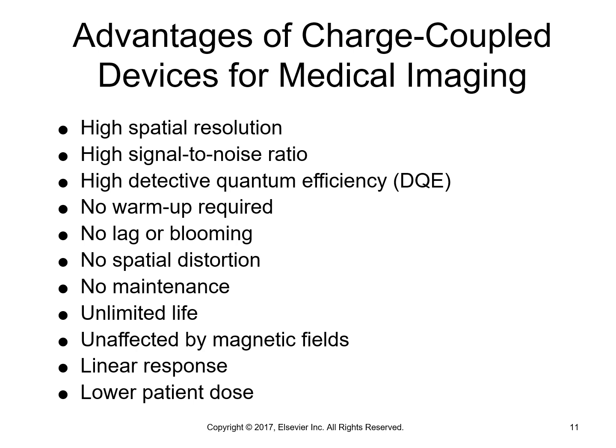And then because the thing is so much more efficient than previous technologies, you don't need as much radiation to stimulate it ultimately. And so we can get away with lower MAs for digital fluoroscopy, operate at lower MA stations than we did with previous technology fluoroscopes.